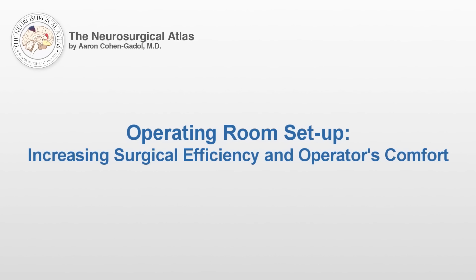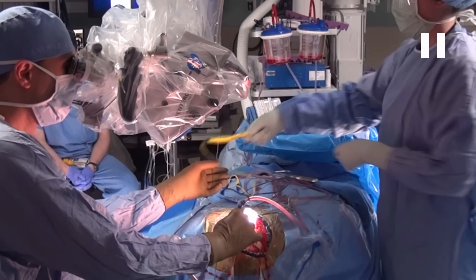Operating room setup is important for increasing surgical efficiency and the operator's comfort. As you can see in this video, the surgeon is sitting across the patient from the surgical assistant.